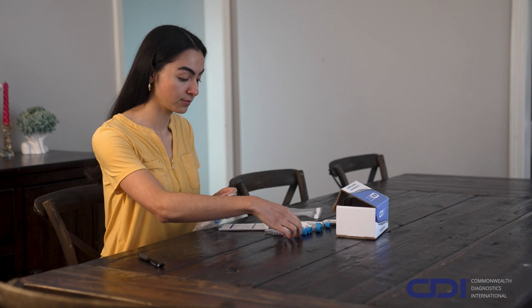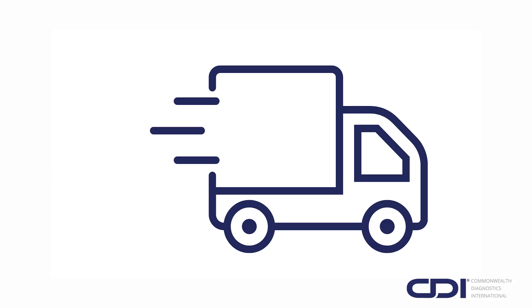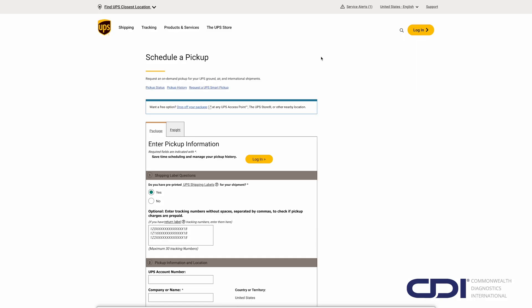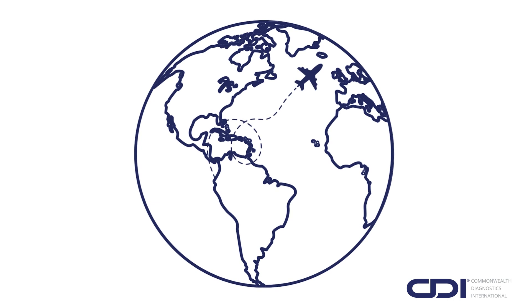Once all samples are collected, pack the test tubes back into the kit, seal it with the provided label, and send it back to our lab. Samples must be received within two weeks of collection. You can return your kit via any UPS location, driver, or even schedule a pickup at ups.com/pickup. For international returns, please contact CDI for guidance.